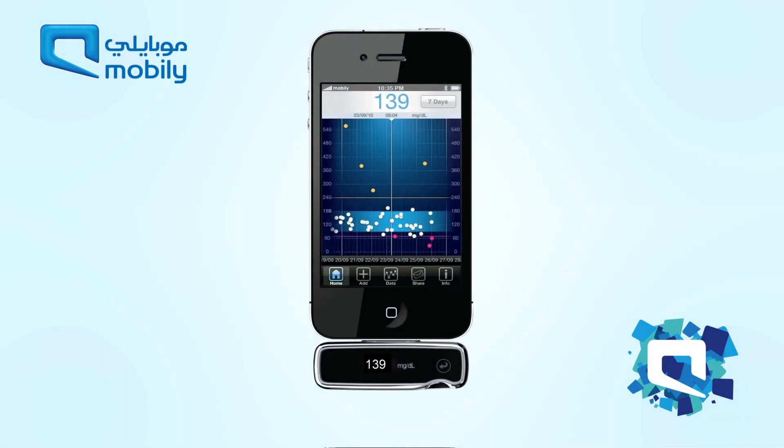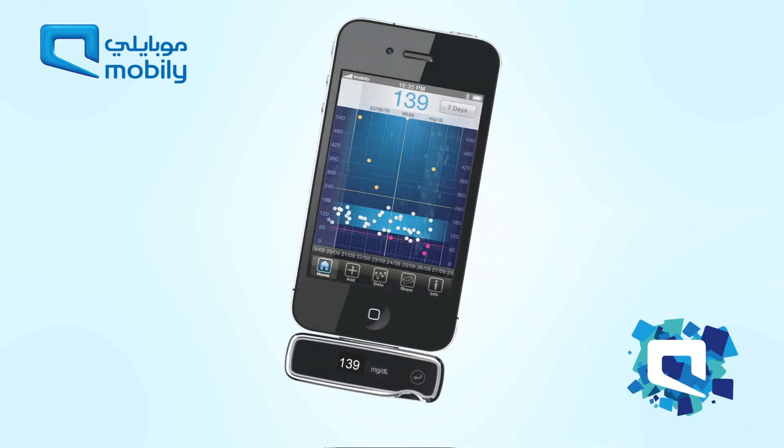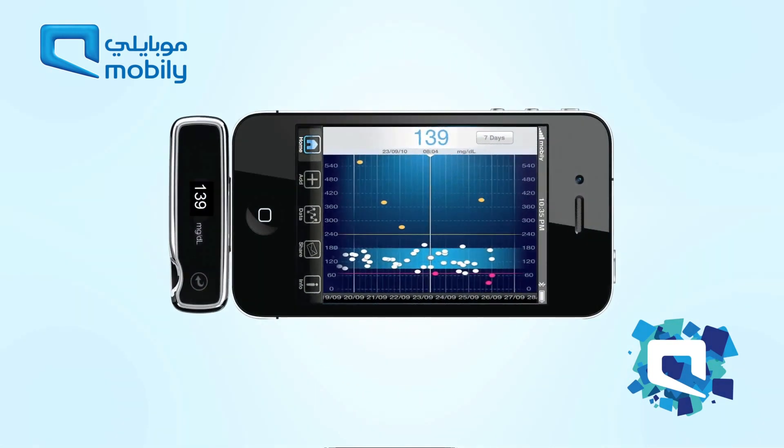Test results stored in the meter's memory and visualised on charts of the IBGSTAR Diabetes Manager app can help identify blood glucose patterns over time.